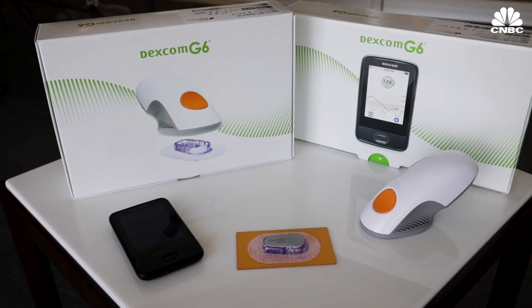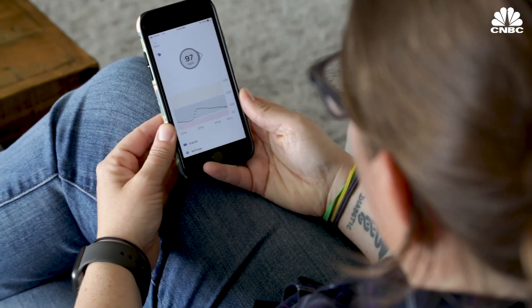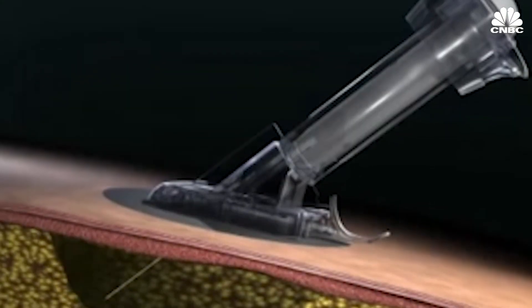Now there's a new device that requires no finger pricking at all. This is the new Dexcom G6 Continuous Glucose Monitor. CGMs allow diabetics to see their blood sugar throughout the day and night with a sensor that is inserted under the skin.